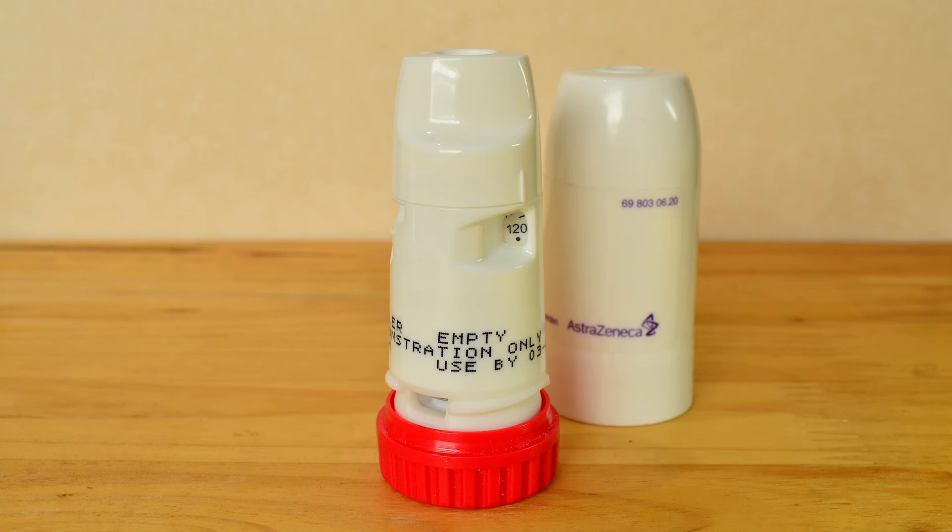Kia ora, my name is Tasha and I'm a pharmacist at Auckland City Hospital. Today I'm going to show you how to use your Turbuhaler.